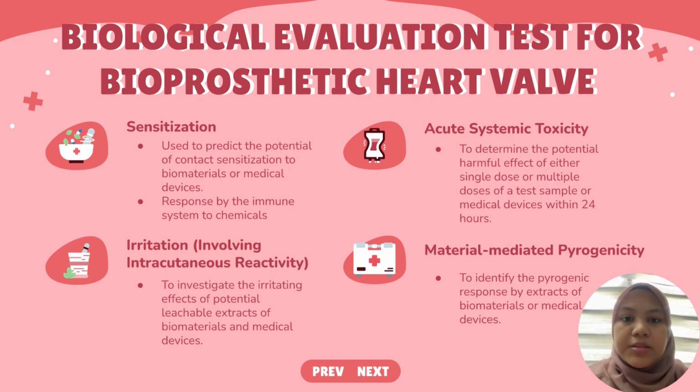Number 4 is acute systemic toxicity. It is to determine the potential harmful effect of either a single dose or multiple doses of a test sample or medical device within 24 hours.